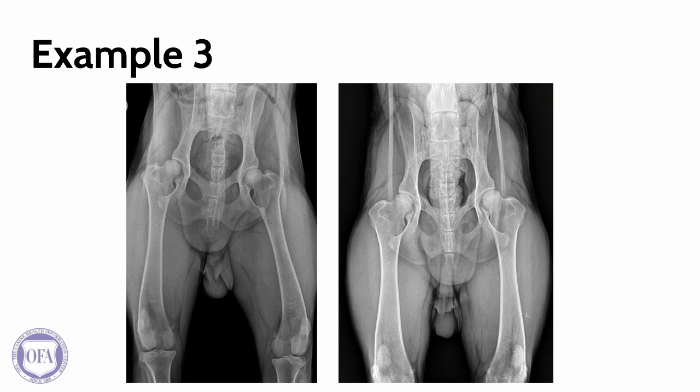The limbs, however, are externally rotated, as is seen with the lateral location of the patellas. The limbs are also not parallel, and the left is angled slightly laterally. The mild pelvic rotation and pelvic limb positioning are resulting in the right hip appearing to have decreased coverage of the femoral heads by the acetabular rims, as well as having subluxation of that right hip.